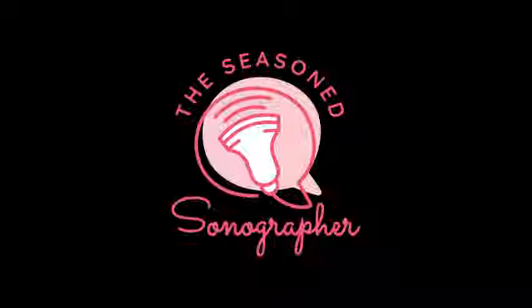Okay, so I want to review technique for sonographers. From a sonographer perspective, technique matters because management decisions rely on these numbers. The umbilical artery Doppler is clinically valid after 24 weeks gestation. In order to perform the umbilical artery Doppler, you want to identify the 3-vessel cord and the arteries using the color Doppler.